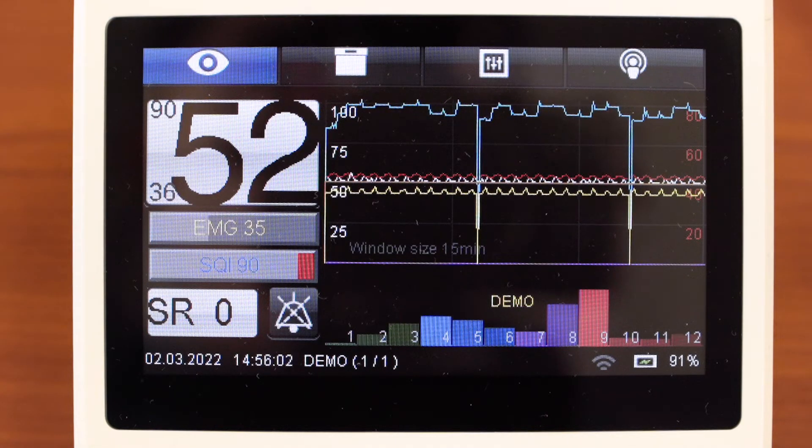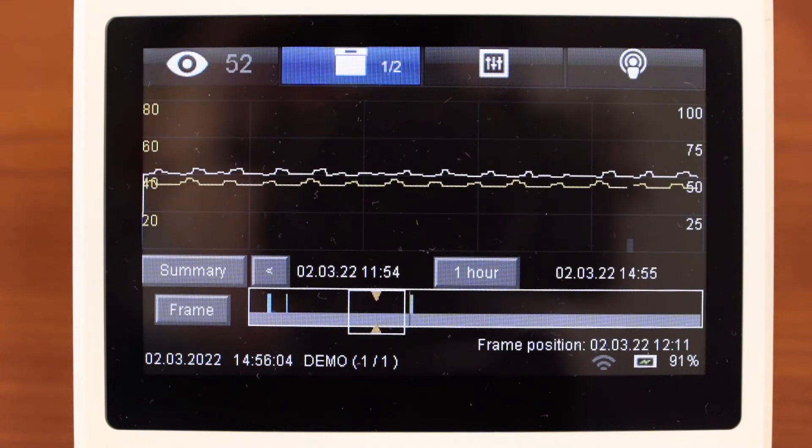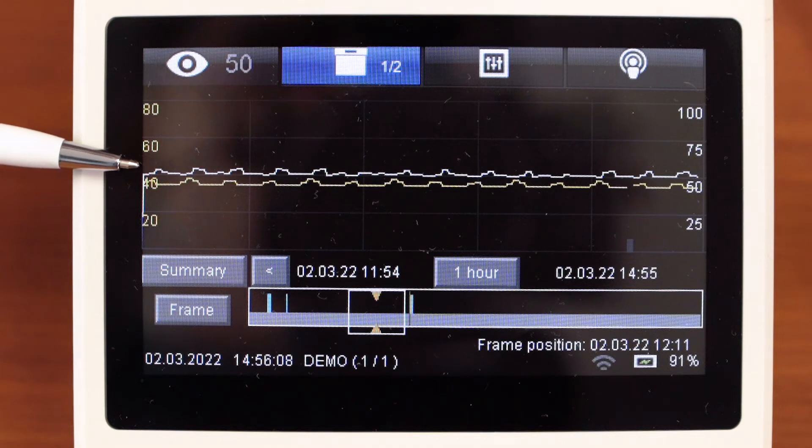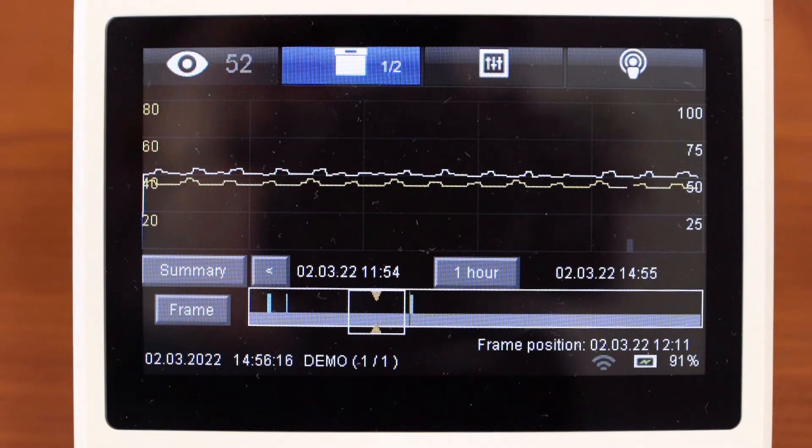The next window is trends. There are two trends: brain activity index white and electromyography component yellow. The device can record trends within 72 hours.